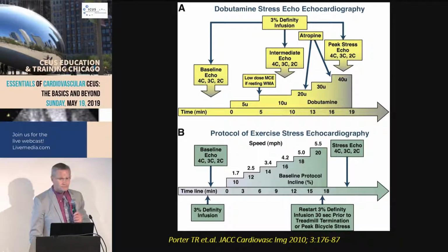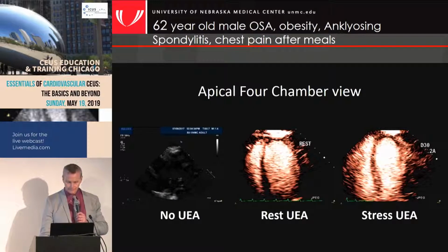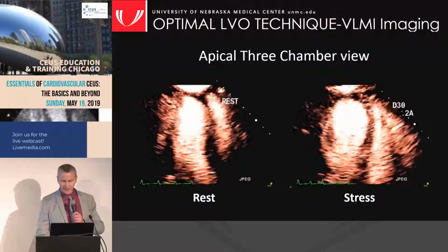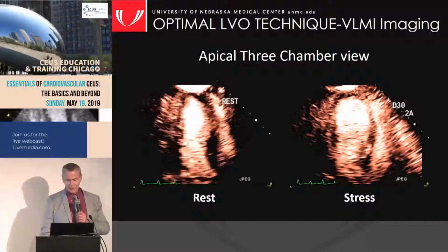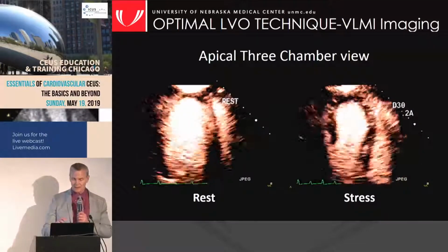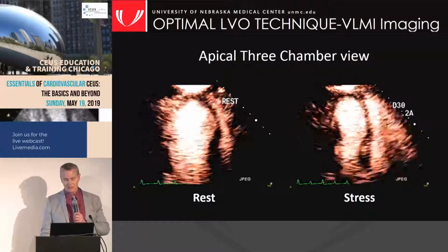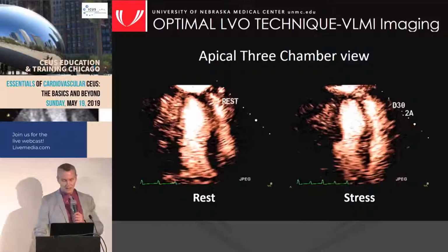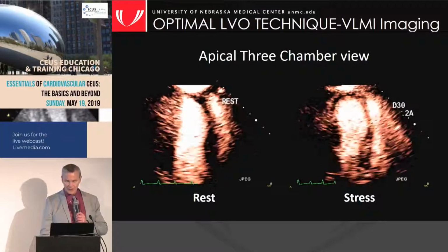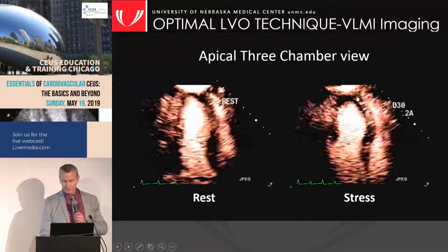So Tom, what would your interpretation of the images be? Because he had resting abnormality. You think it worsened for additional ischemia, or how would you put that together? Right. So you have this resting abnormality, and this goes back to the viability issue. Now, what I didn't show here is during low dose, I think you can even see here, there's a little bit of augmentation in those segments that are severely hypokinetic at rest. So we were primarily looking, does it still pick up a little bit during dobutamine infusion? And then we'll talk about the perfusion as well.